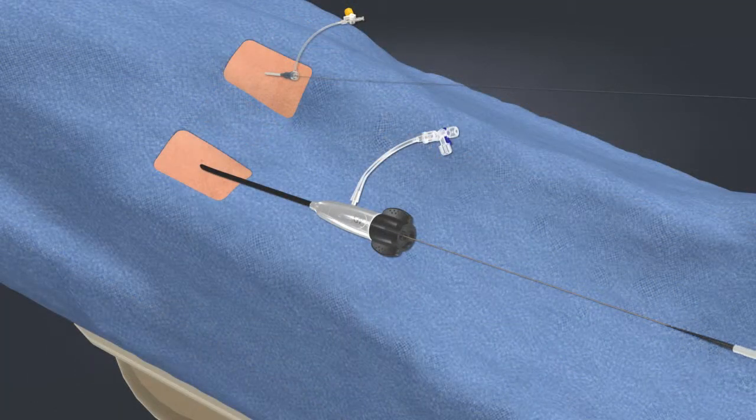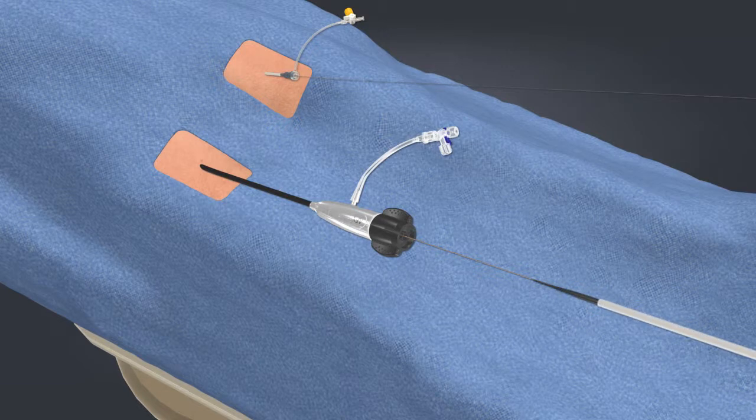Load the bifurcated delivery system onto the 0.035 guide wire.